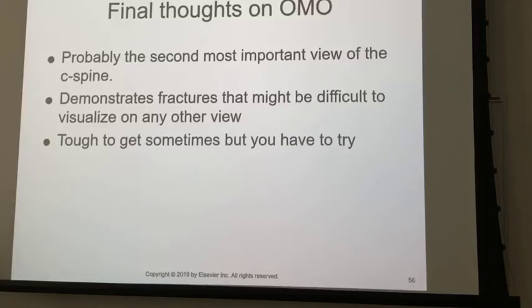Have y'all seen anybody shoot a Fuch yet? No? Good. I'm glad to hear that. Because for a while there, nobody was really trying to get a good open mouth odontoid, and everybody was relying on Fuchs. I'll tell you why here in a minute. Fuchs, you shouldn't do that. All right, so work very hard to get a good open mouth odontoid, and if you just can't get the tip of the odontoid process, and the doctor absolutely insists he needs to get the tip of the odontoid process, then you can rely on Fuchs, and I'll talk about what Fuchs is here in a minute.